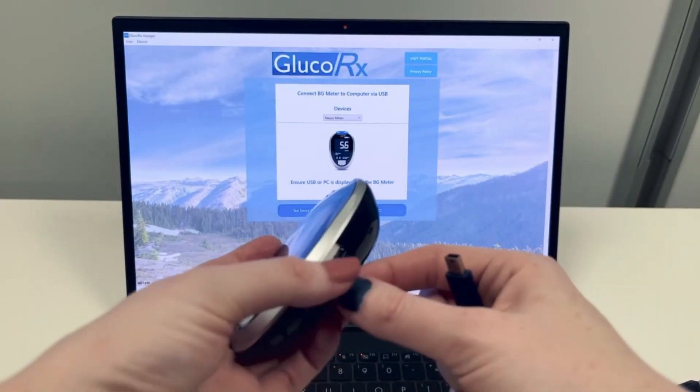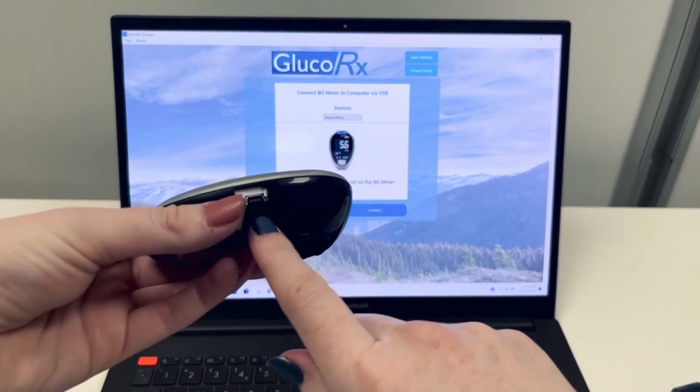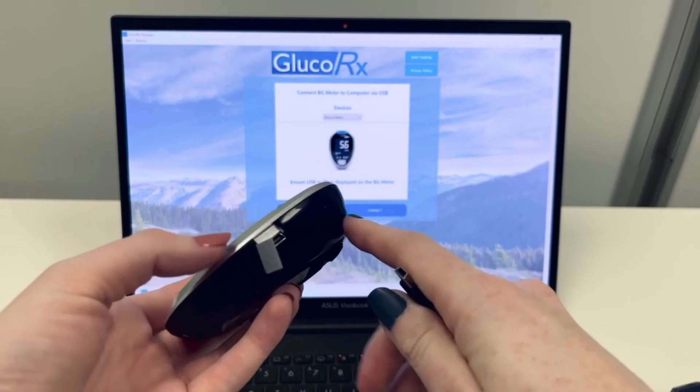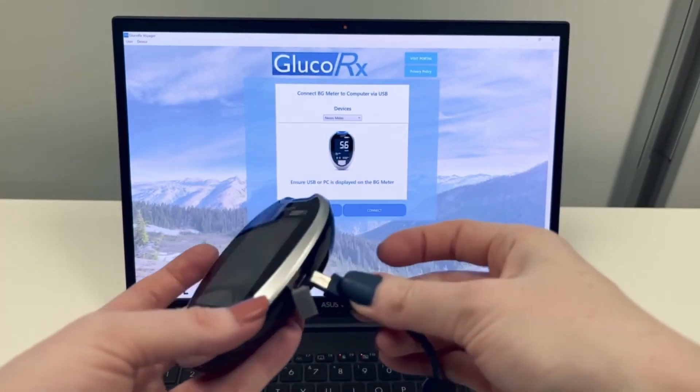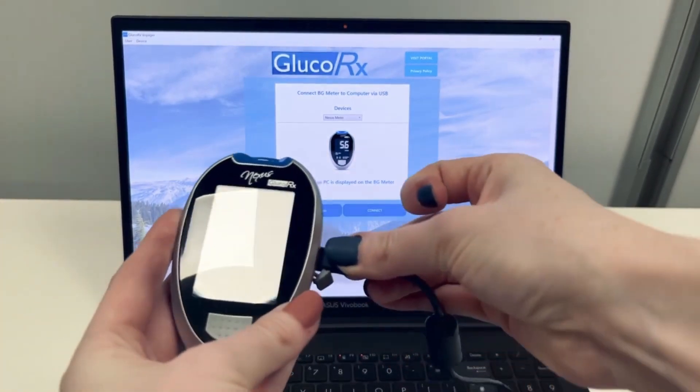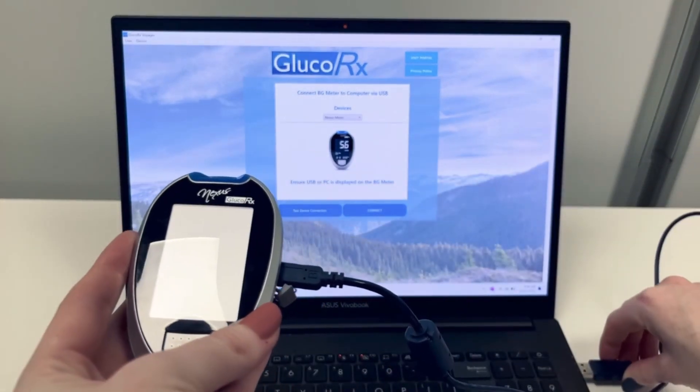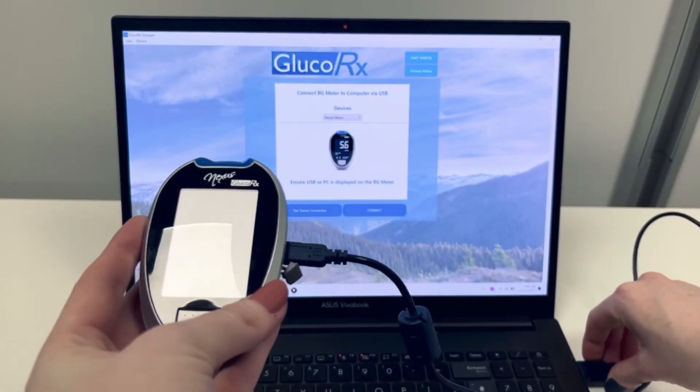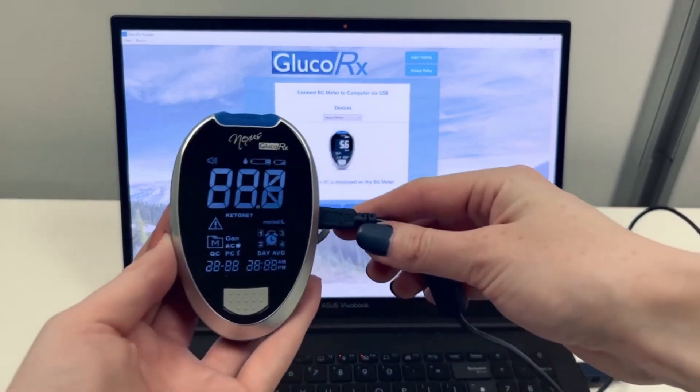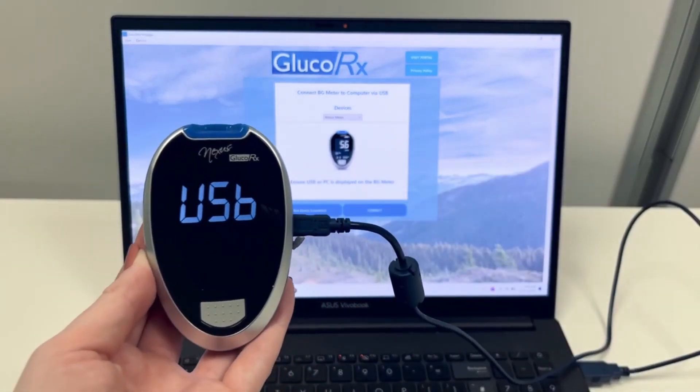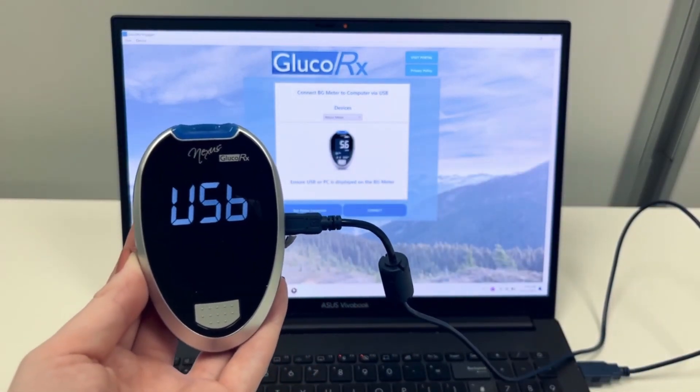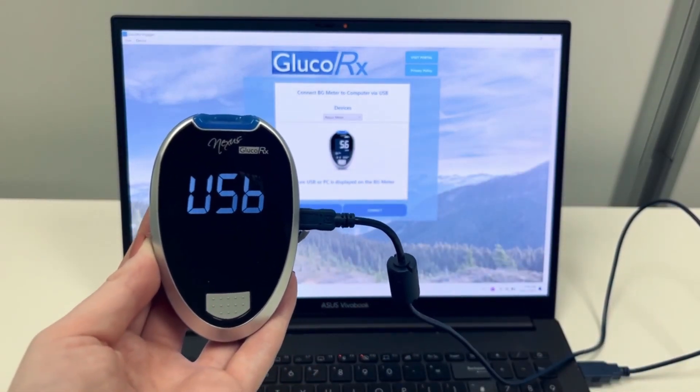Open the USB connection tab on the side of your GlucoRx meter and connect the cable. Insert the USB connection into your computer. Your meter will display USB on the front screen.